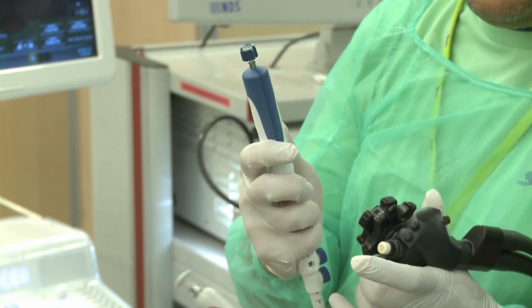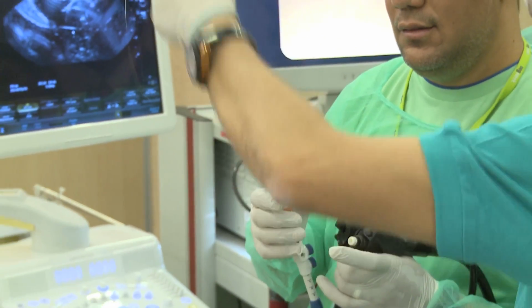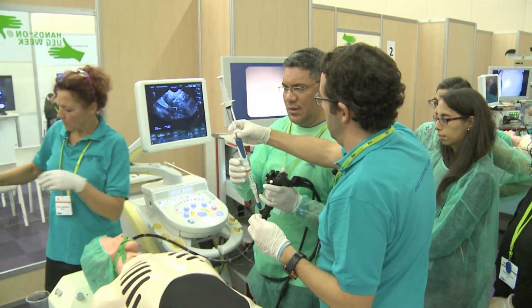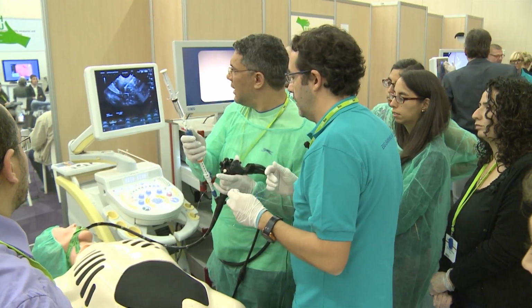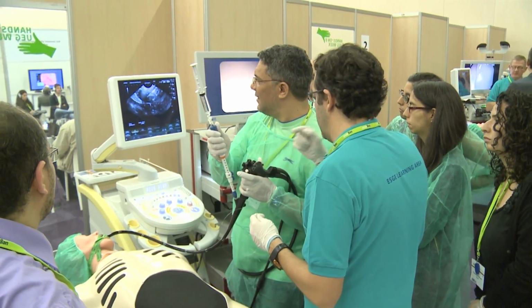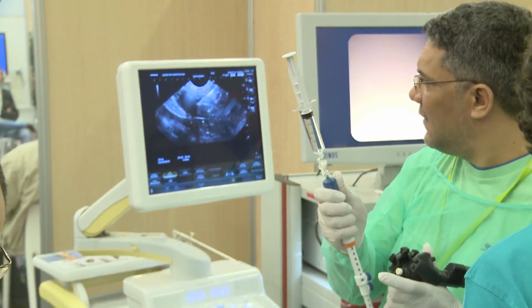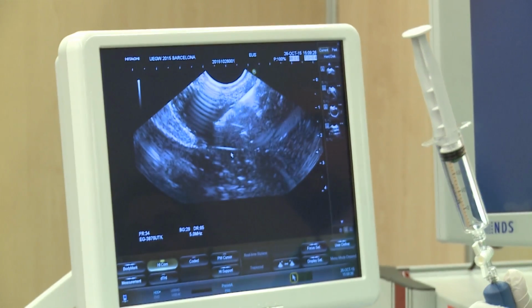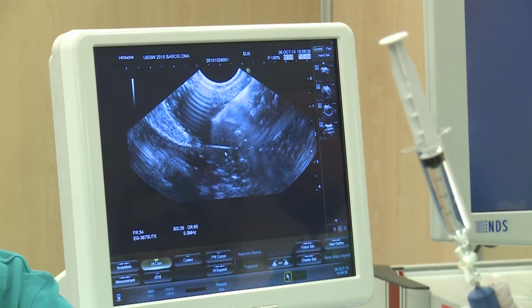So once you finish, in this case what we should do is remove the stylet, place the syringe, open, and to and fro. And you always need to look at the needle, because you can see it all of the time. So this is a completely directed procedure. That is one of the good things of this system, of this FNA, as compared to percutaneous FNA, where you sometimes can lose the position.